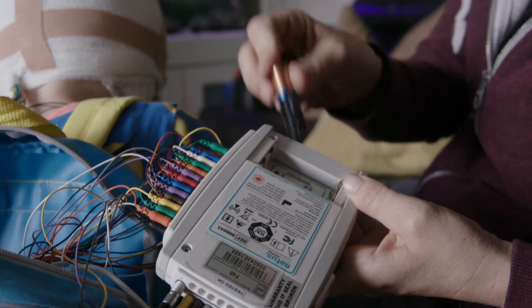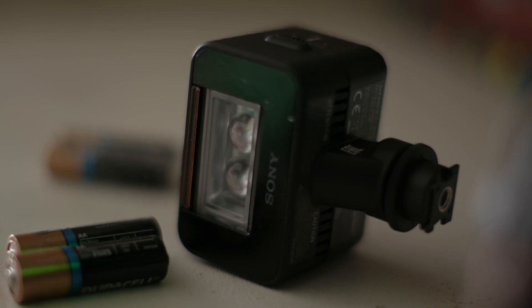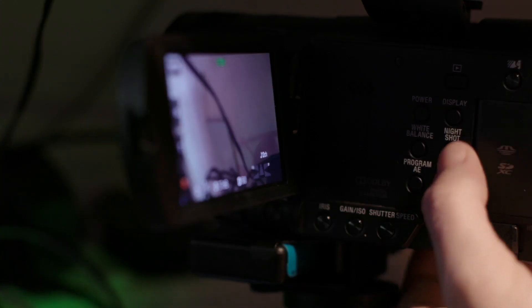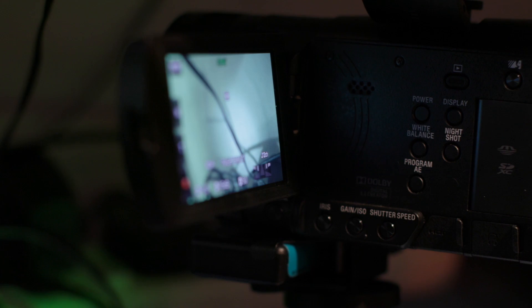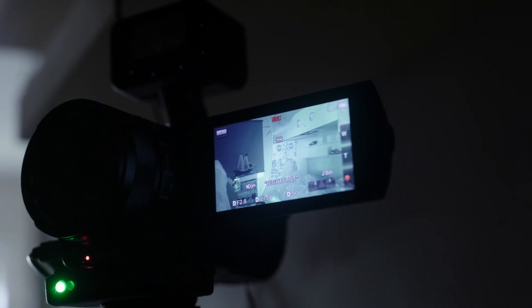If you're recording for more than one night, we'll give you new batteries for the recorder and the infrared light. We'll tell you what time to change them and ask you to set a reminder. At night you will need to press the night shot button on the camera and turn on the infrared light. This makes sure we can see your child clearly even in the dark.